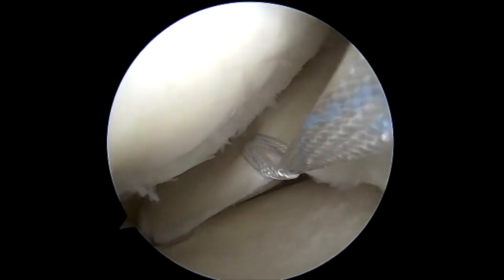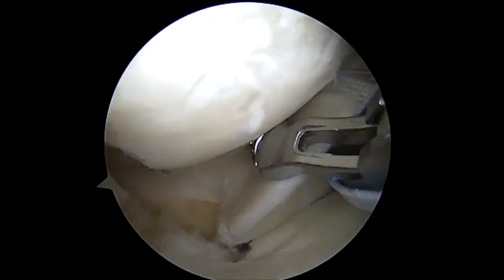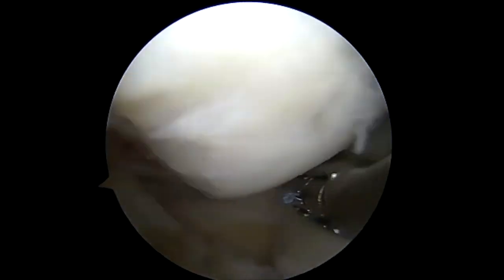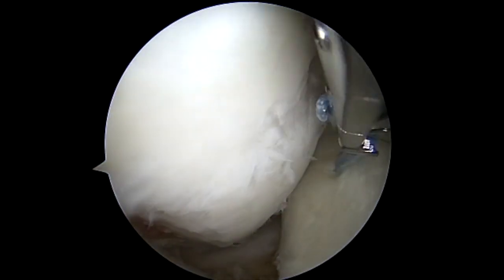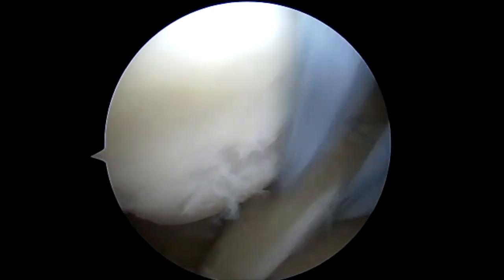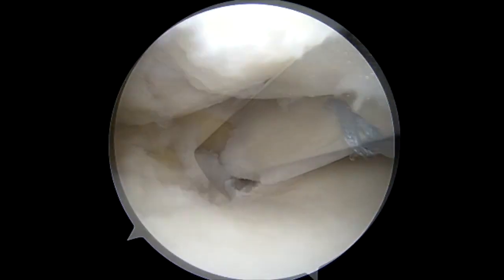Following this, we placed two Smith & Nephew tape sutures in the meniscus. You can see here we do not go right towards the actual meniscal root, as the quality of the tissue can be poor and there's high pullout probability. We tend to get a much better purchase more medially on the meniscus. We have not had any complications with this type of movement and it allows us to further pull over the meniscus.